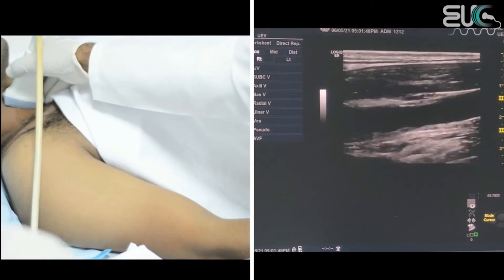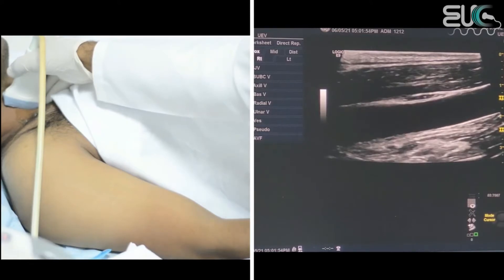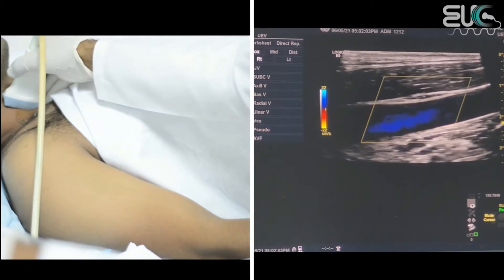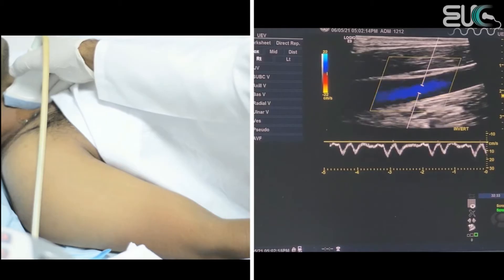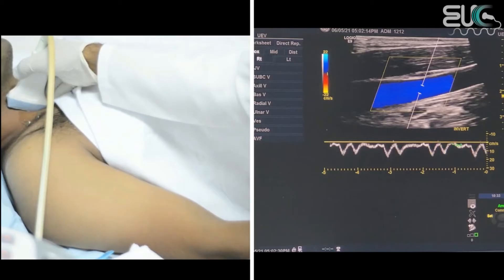After that, I will scan the internal jugular vein on the sagittal plane to make sure there is no internal thrombosis. Then I will apply the color box and steer it until I have a good signal. I will check the pulse wave by applying the pulse wave. As we can see, the internal jugular vein, because it is a central venous vessel, has respiratory phasicity and cardiac pulsatility.